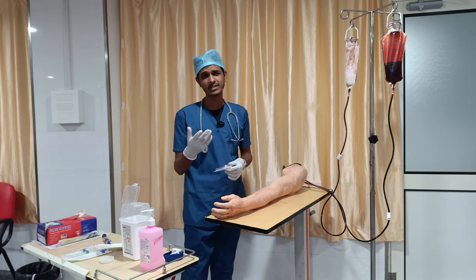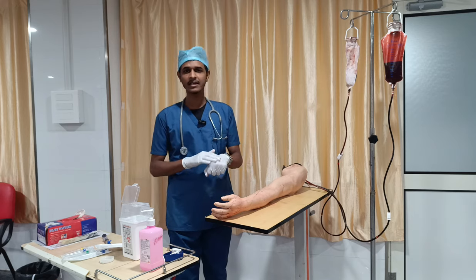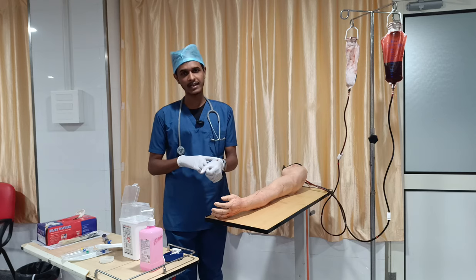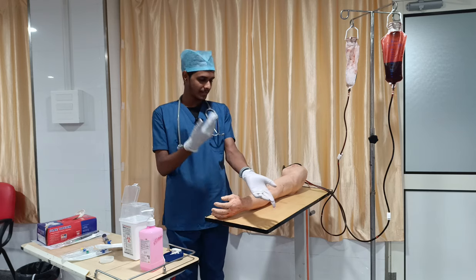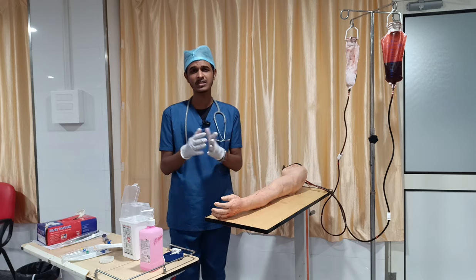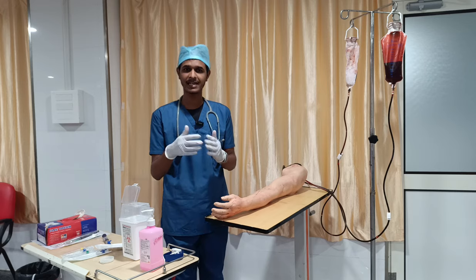And what are the common sites we regularly use? We have the metacarpal region, where you can see the veins, and then the cephalic regions, and we also have the accessory cephalic, and then in the cubital region we can choose. But if you choose the cubital, the majority of the time there are chances of catheter dislodgement or occlusion.